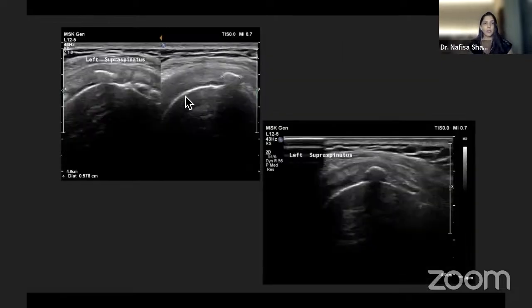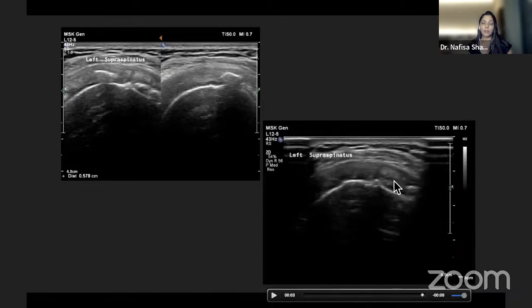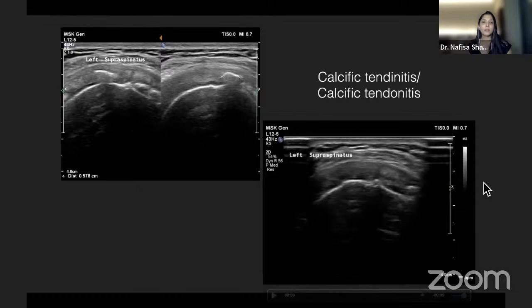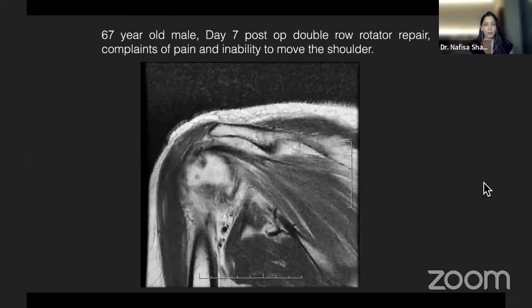So this is another patient, supraspinatus. He had multiple calcific deposits within the tendon. And again, ultrasound beautifully demonstrates these. You can also go about injecting or doing a barbotage, and ultrasound is a great modality for diagnosis as well as follow-up. Here's a patient post-op case MRI.